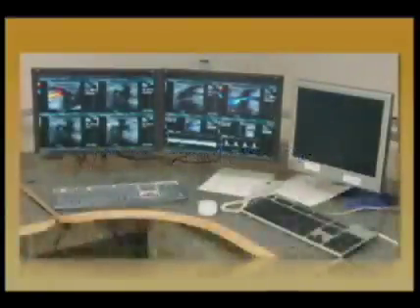Well, so much for images, and I think by now you've gotten the idea that these images are certainly able to provide maybe some increased confidence in what we were already seeing with 2D, although it's open to question whether they would allow you to make a diagnosis that you absolutely couldn't make before. But I think in some respects, the more important or significant promise of 3D imaging in the abdomen is increasing efficiency. And this is one that I think the ultrasound vendors are particularly interested in.